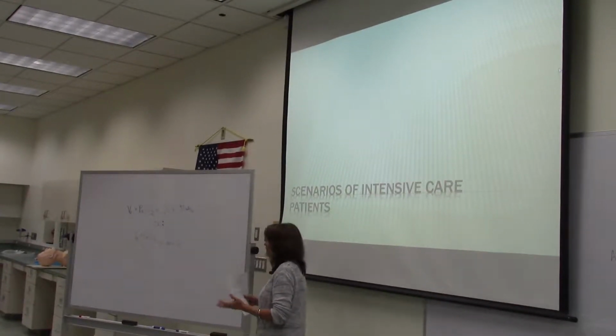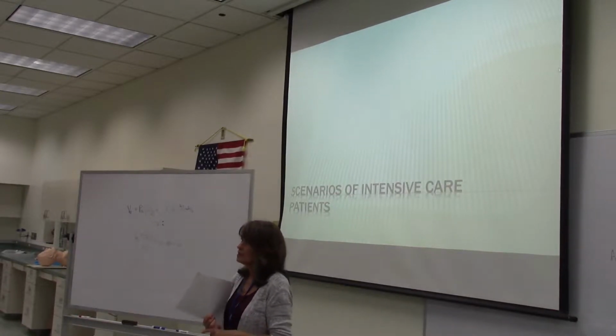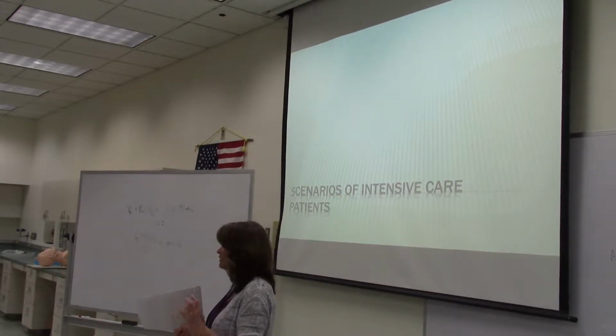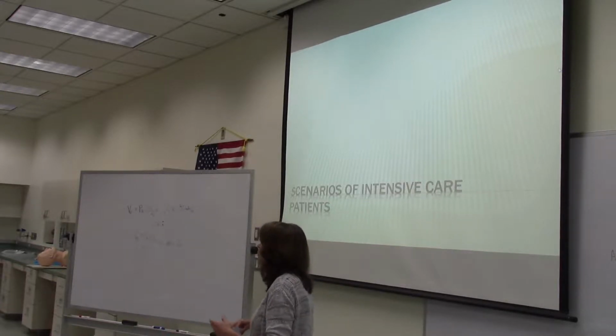So that new minute ventilation is what you'll target with your ventilator changes. Typically it's a change in the respiratory rate, but it could be a change in the tidal volume, if the tidal volume is not the 6 to 8 mLs per kilo, or 4 to 6 if it's ARDS.